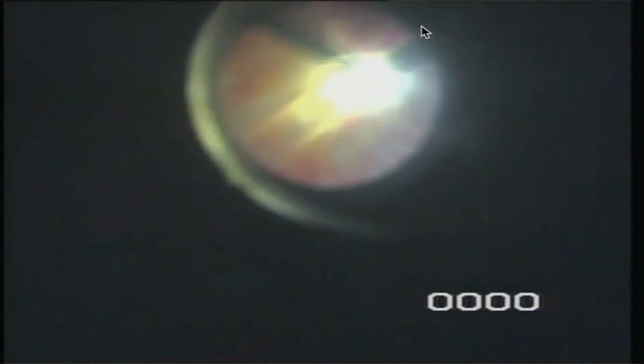I am not going to show bimanual, so that is the break which we were discussing. That's the tiny break which we were able to identify. I'm sorry, there is a lot of blooming over there, but that's the tiny break. And then you assess the degree of adhesion of the fibrovascular tissue to the subjacent retina by trying to elevate.